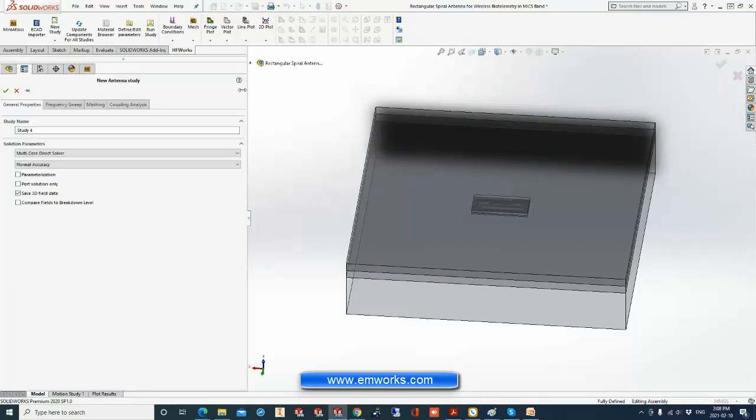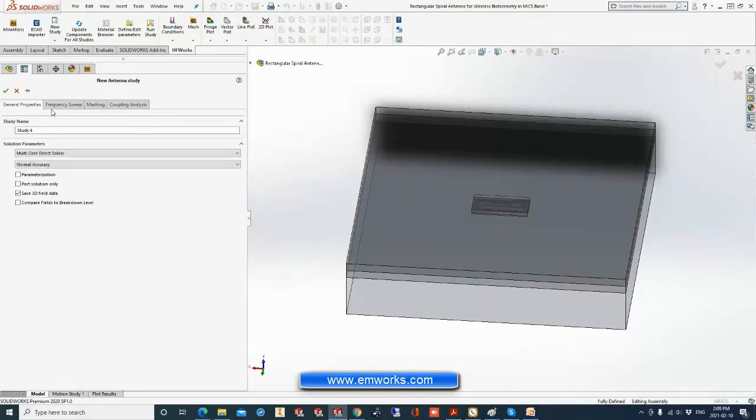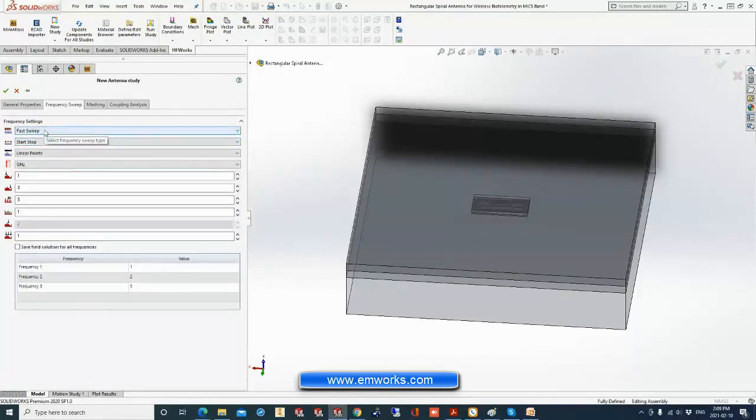So we create an antenna, and here in the interface we define the properties of this simulation, such as, for example, the frequency band. We can use discrete sweep or fast sweep. The difference is, for discrete sweep we solve the problem for each frequency one by one, and for fast sweep we just define our band and the number of points, for example 100 points. Based on the solution, where we can control the number of solutions, we can interpolate for the other frequencies.